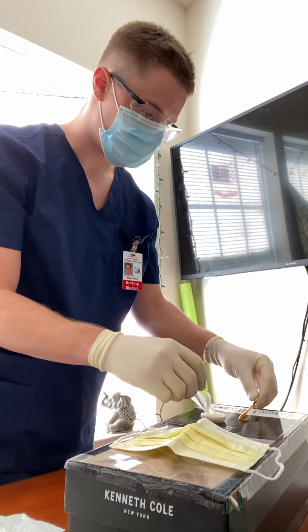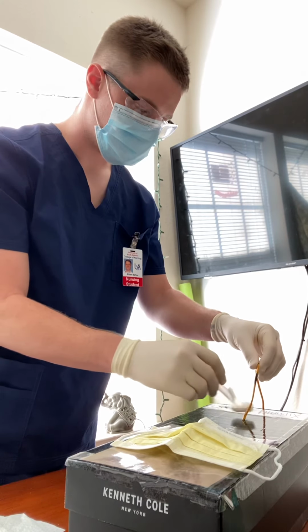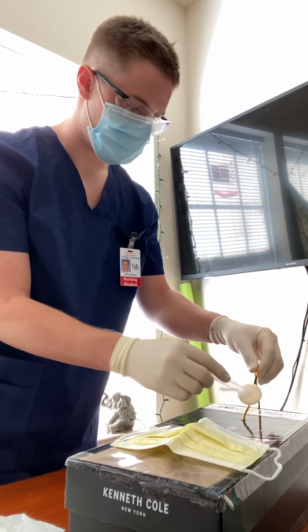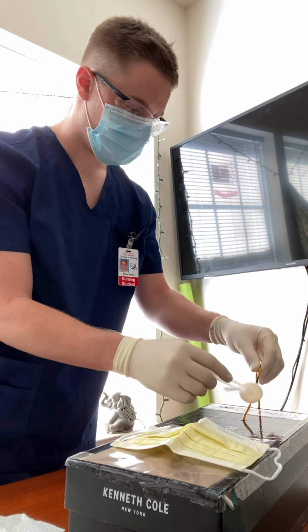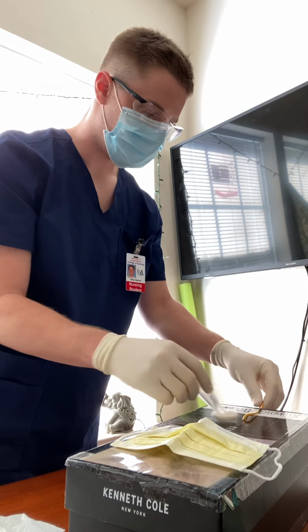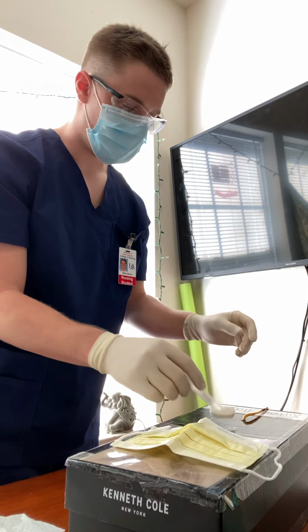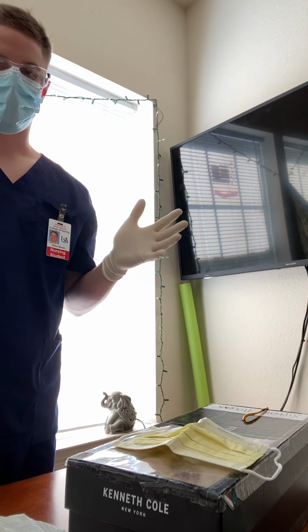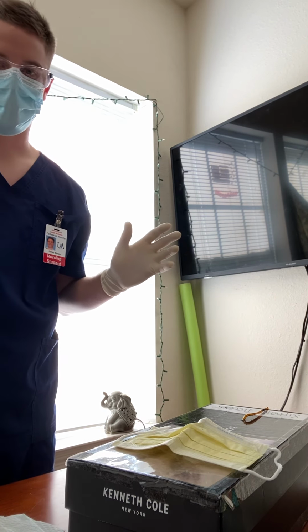I'm picking up the catheter above the green hub, horizontally. And I'm also going to clean the catheter all the way up to the green hub. I'm doing this for 30 seconds. After this, the hand is now contaminated. And now I'm going to dispose above waist level. And now I'm going to let it dry completely before I apply the bio patch.